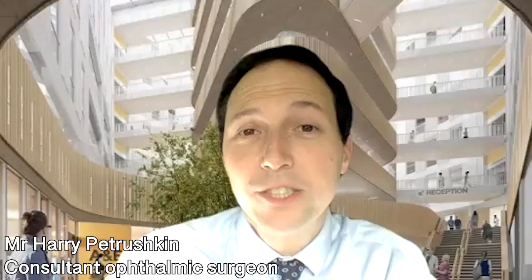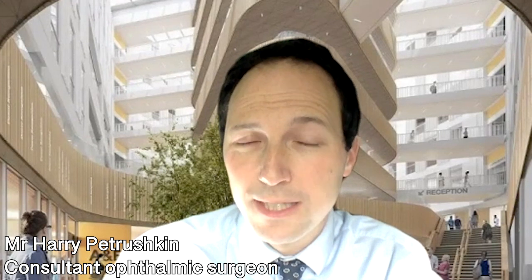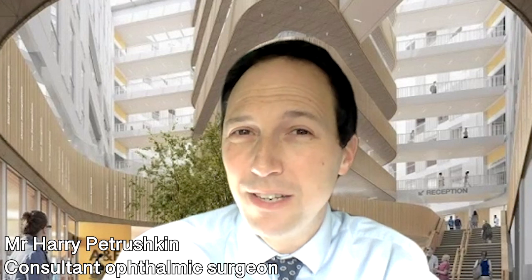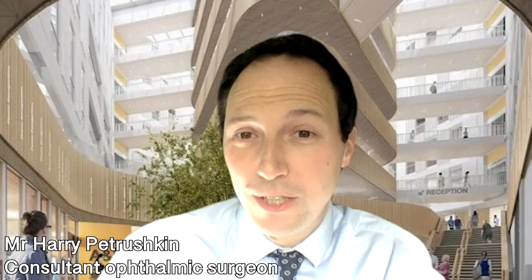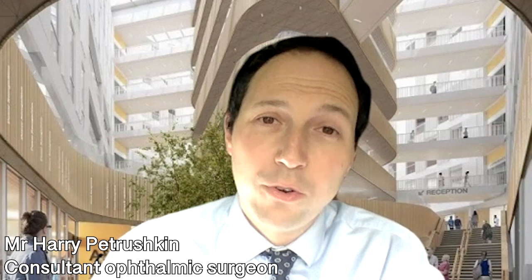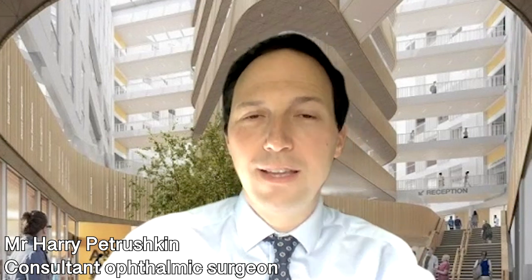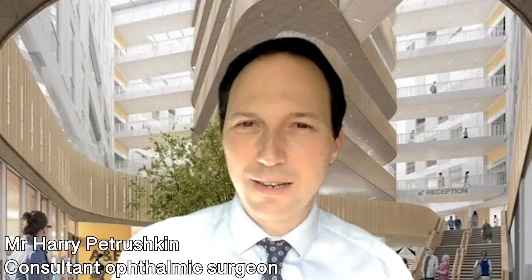So that's a really good question. It is possible to take a lens out of an eye once it's been implanted and put a new lens in its place, but it's definitely not something you should choose to have or should aim to do, because that procedure itself can be quite complicated. And often while trying to take out an old lens, it's so embedded inside the eye that the architecture of the eye, the place where you put your new lens, won't sit nicely.